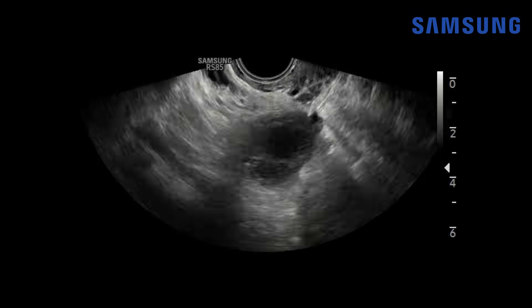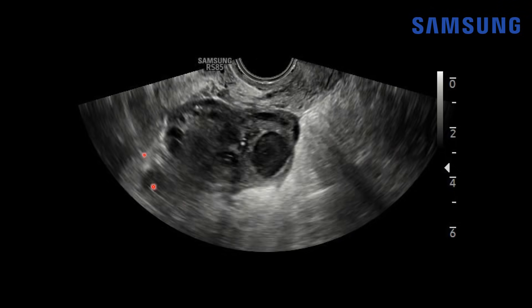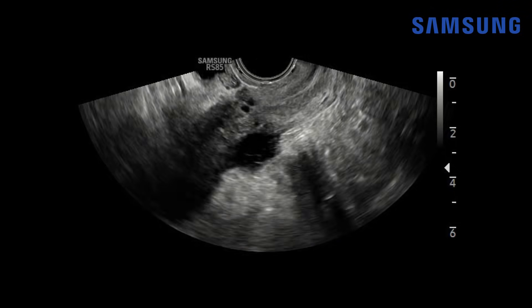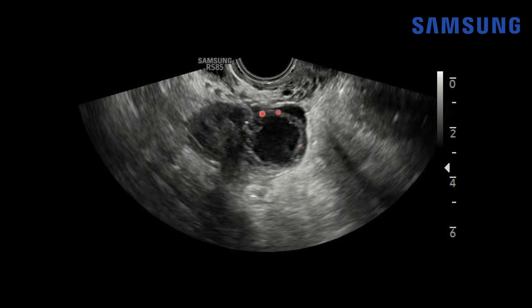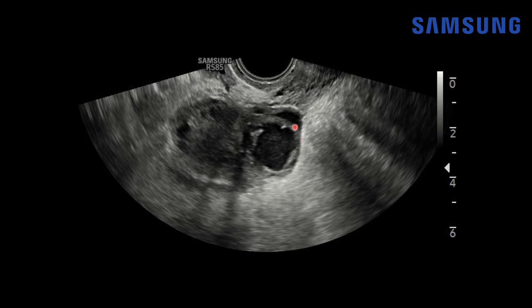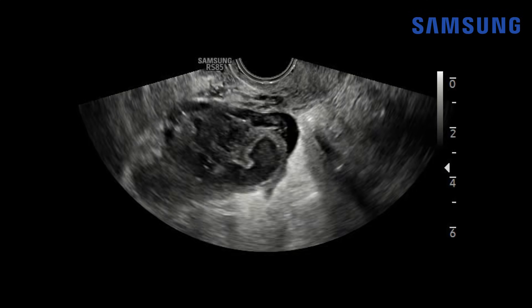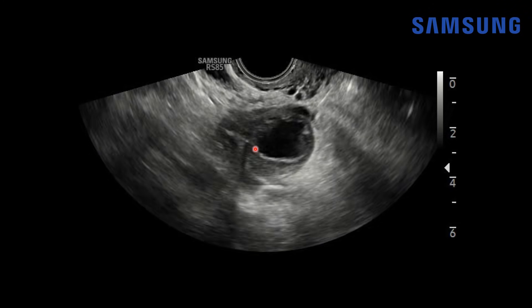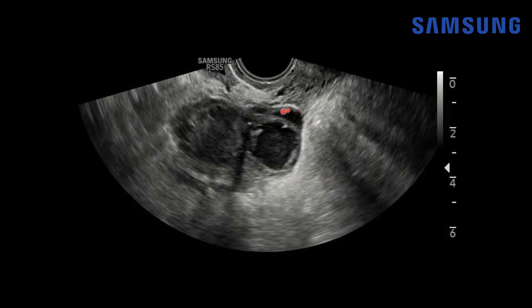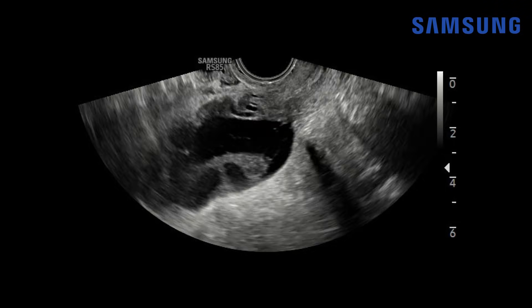Now let's look at another case — a patient in her late 20s presenting to the emergency department with fever, elevated white blood cell count, and pelvic pain, with a suspected clinical diagnosis of pelvic inflammatory disease. On this transvaginal sagittal view through the right adnexal region, we have a dilated fluid-filled fallopian tube, but what's different here is that it's thick-walled, and instead of simple anechoic fluid it contains heterogeneously echogenic complex fluid. There's also some adjacent complex fluid with septations.